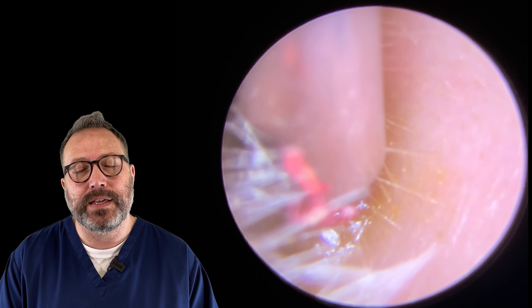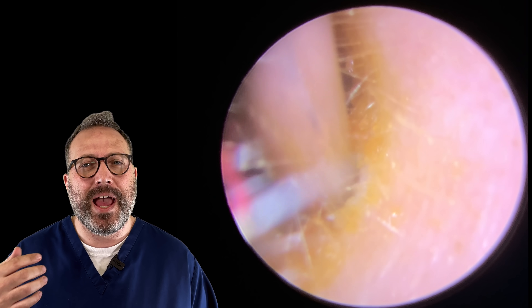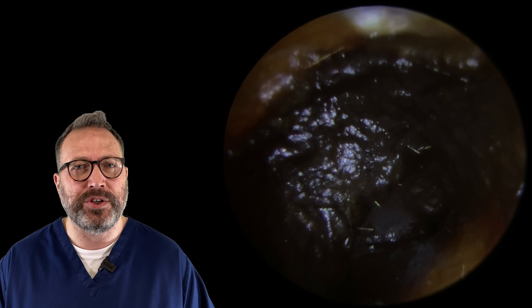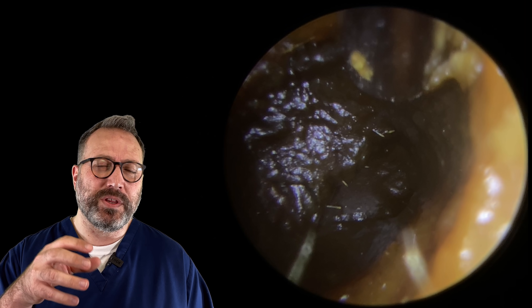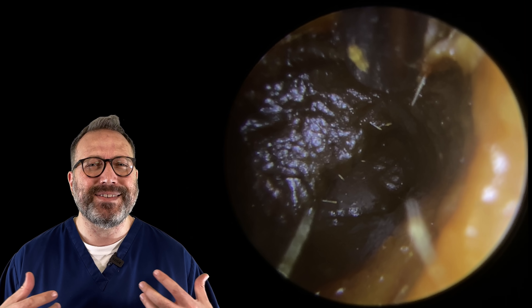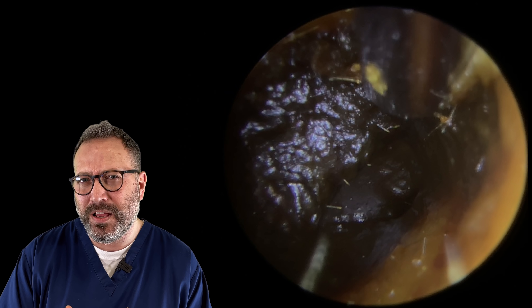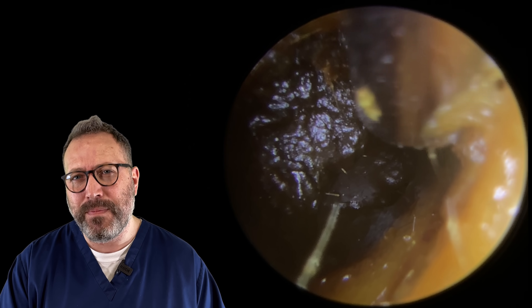This first patient came in with a very blocked up ear canal, just on one side. The patient had been blocked up, used some wax softening drops, and found it just made the situation worse. What's actually happened is the wax softening drop changed the consistency of the wax. We've ended up with a really sticky layer that's just starting to harden up a bit - an odd consistency, completely covering the eardrum and the canal wall.